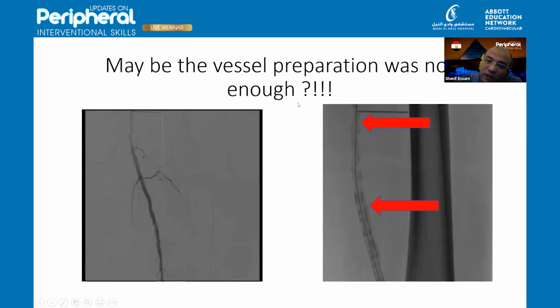Maybe the vessel preparation was not enough in this region. That was our conclusion, why the stent deployed in such a manner. Probably the part of the vessel was not properly prepared. And that's why vessel preparation is crucial before deploying the Supera stent.